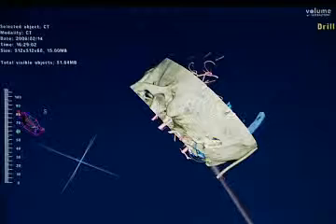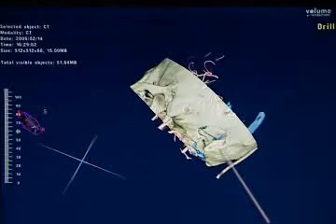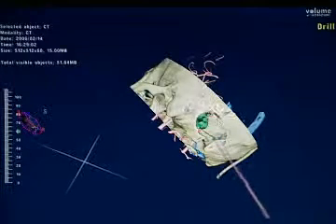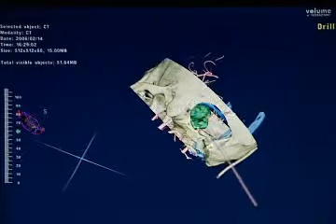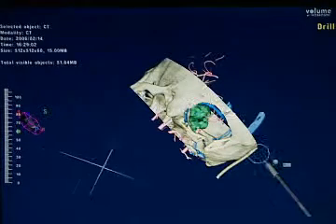I start off with a retrosigmoid approach, and of course in a retrosigmoid approach, you just want to sort of take away the bone laterally, expose the transverse sinus to the confluence of the sigmoid sinus. And of course, that description of the extended retrosigmoid approach, where you literally skeletonize the sigmoid sinus, may be useful in extending exposure. And so that's the exposure you get from a retrosigmoid approach.